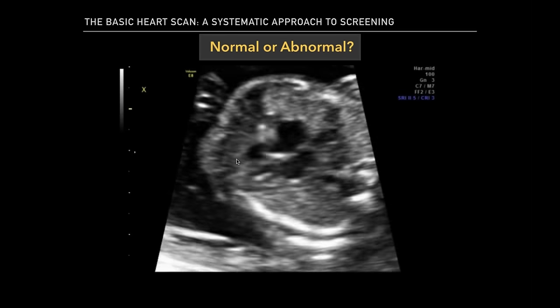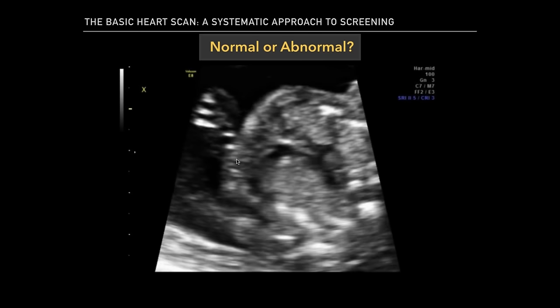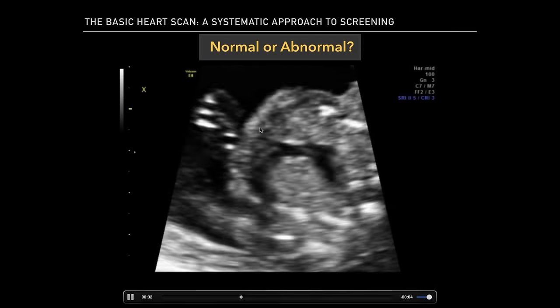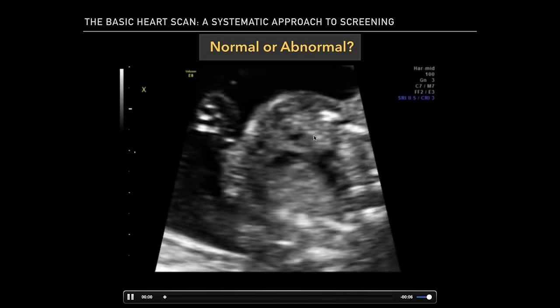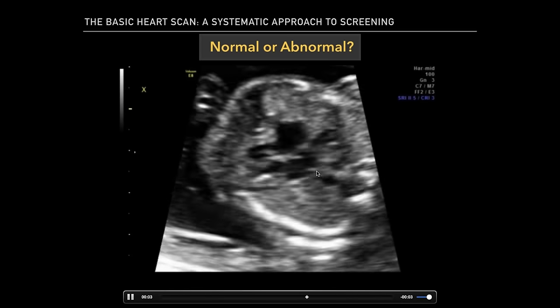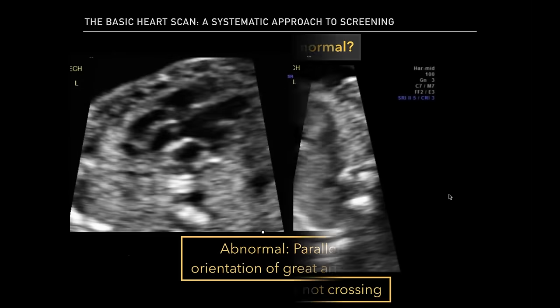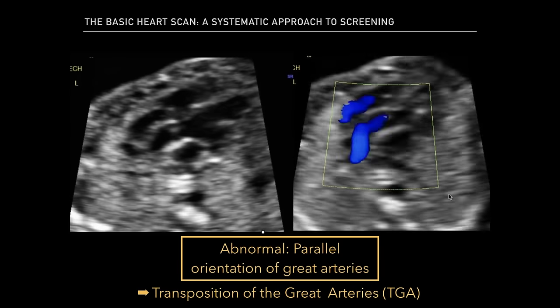So here this was a case that one of the sonographers came and was explaining, well, I can't seem to get the crossing. I don't know what's wrong. So here, as you can see, we see what looks like a four chamber view, but we are unable to see that crossing as we go up to the neck. So obviously this is abnormal. We don't see any vessels crossing. And this baby ended up having transposition of the great arteries.